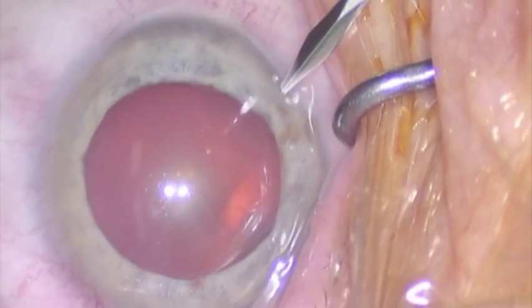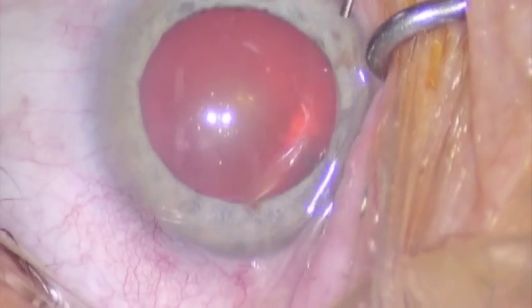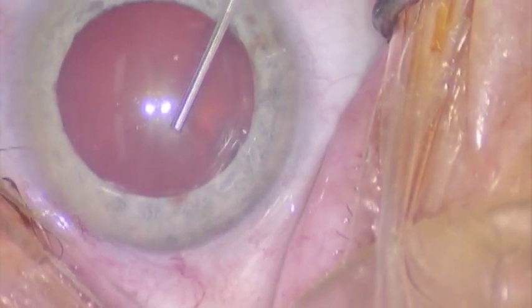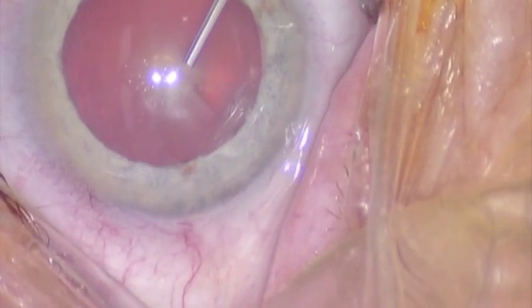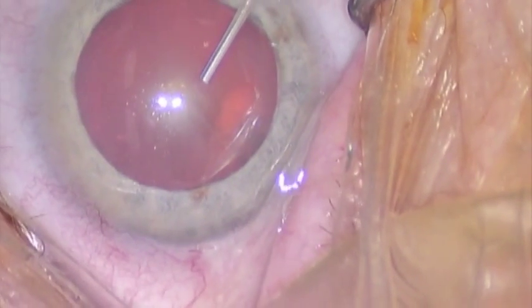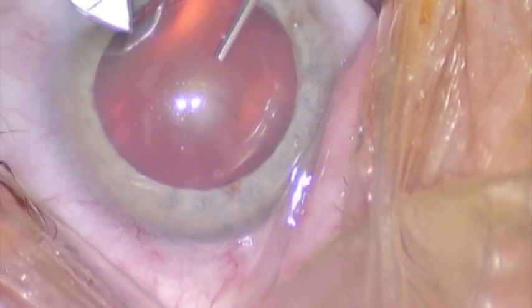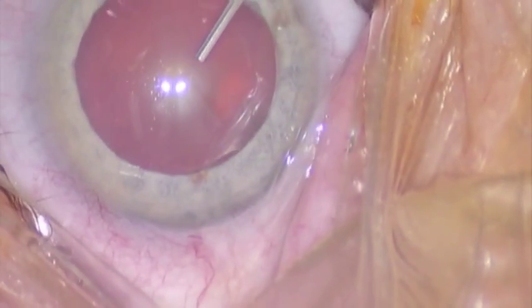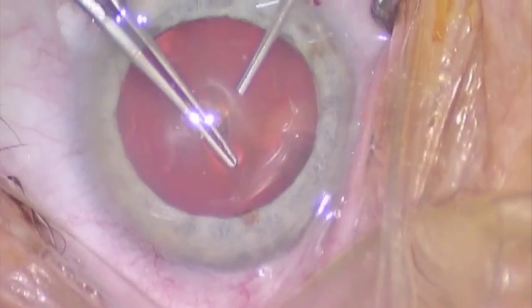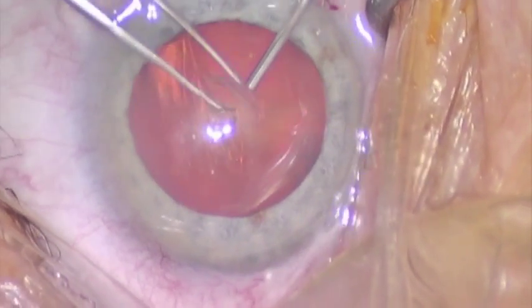This is a demonstration of the Perfect Plus Technique, a no-rotation, high-efficiency technique, in which we start doing a phaco in a normal manner, but because we may be dealing with conditions such as pseudo-exfoliation, or conditions where there's zonular dialysis as in trauma, or in conditions where we just don't get a good hydrodissection and the lens doesn't rotate well, it is very, very useful to have a technique which doesn't depend on rotating for every groove and every sculpting and every crack that we do.